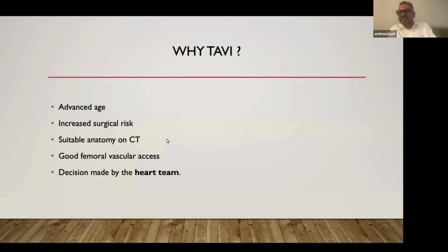So this patient had an Agatston score of 2,300. So by definition, he was severe AS. And then we discussed it in a heart team meeting, which each TAVI candidate has to go through, which is a combination of interventional cardiologist, cardiac surgeon, structural heart coordinator. We have the cardiac anesthetist, geriatrician. So we discuss the case, we go through the images, through the CT pictures.